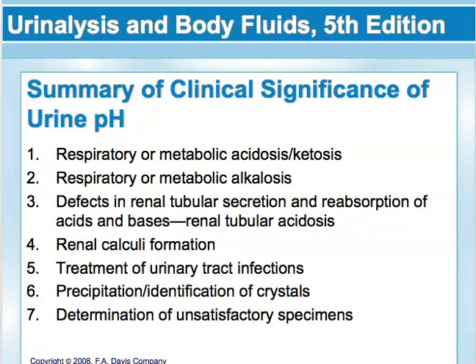The pH of fresh urine should not exceed 8.5 in normal or abnormal conditions. Therefore, a pH above 8.5 is associated with an improperly preserved specimen and should be recollected. Even with the experience that I just shared with you, if I had a sample that was 8.5 or higher, even knowing that it is possible, I would still ask for a recollection.